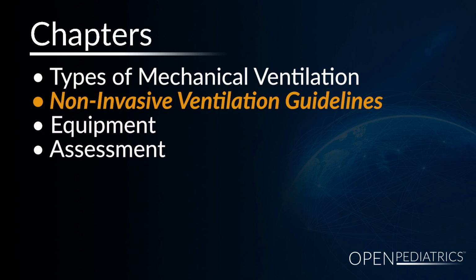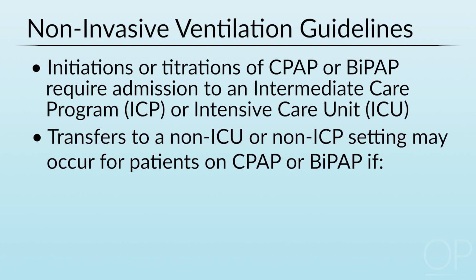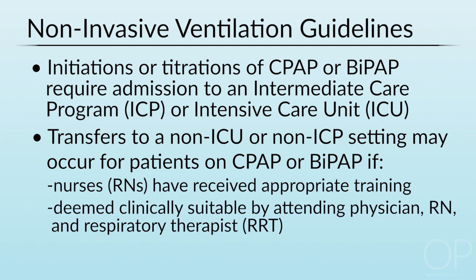Non-invasive ventilation guidelines. So who gets non-invasive? Initiations or titrations of CPAP or BiPAP require admission to an ICP or ICU. Transfers to a non-ICU or non-ICP setting may occur once a patient on CPAP or BiPAP settings are established using the guideline below. CPAP or BiPAP may be provided on inpatient units where nurses have received training and demonstrate competency. Patients requiring BiPAP or CPAP who are being transferred to a non-ICU or non-ICP setting should be clinically suitable as agreed upon by all attending, RN or RT.